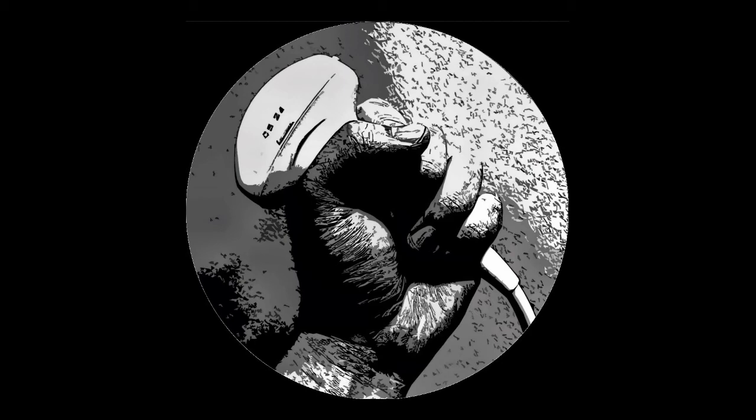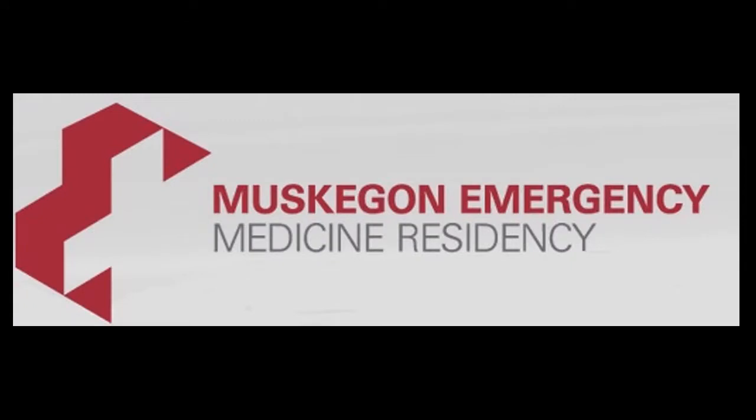Hey everybody, Joe Betcher here with the next Ultrasound of the Month. This one was performed by Dr. Wilson. A patient came in with a bright red, swollen, painful wrist and we needed to perform an arthrocentesis.